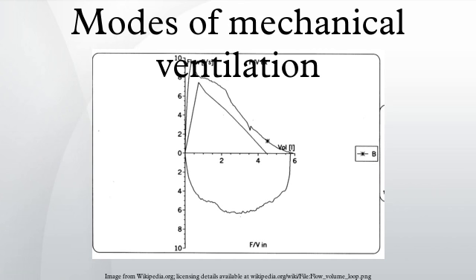functioning as a high-efficiency heat exchanger. Despite its theoretical advantages, efficacy studies have been disappointing and the optimal clinical use of LV has yet to be defined. Total liquid ventilation. In total liquid ventilation, the entire lung is filled with an oxygenated PFC liquid, and a liquid tidal volume of PFC is actively pumped into and out of the lungs. A specialized apparatus is required to deliver and remove the relatively dense, viscous PFC tidal volumes, and to extracorporeally oxygenate and remove carbon dioxide from the liquid.